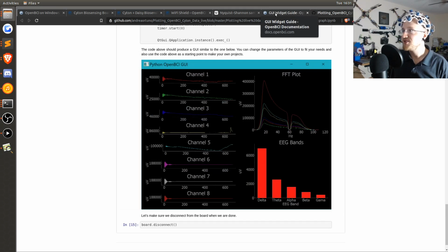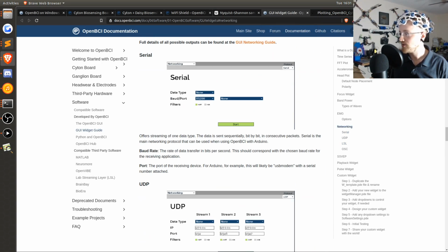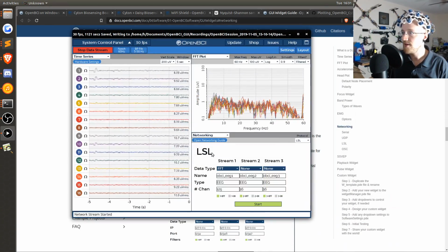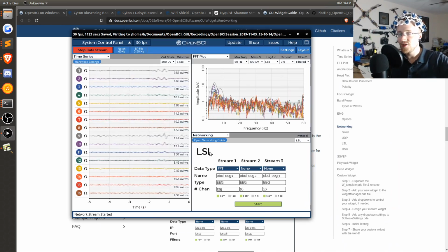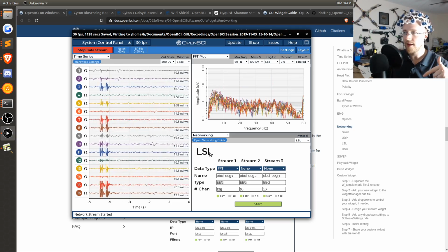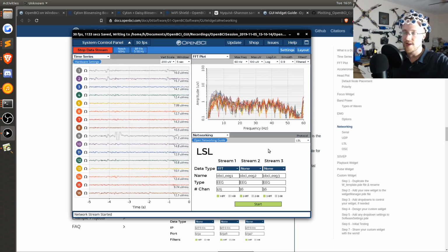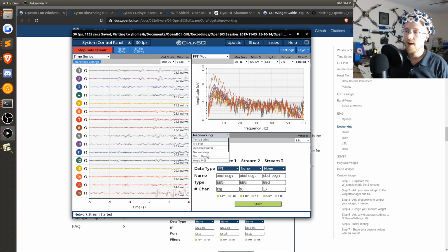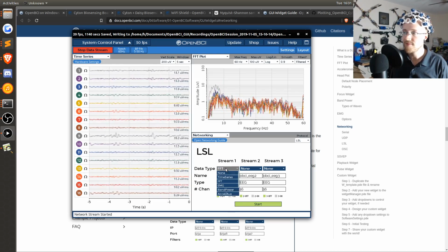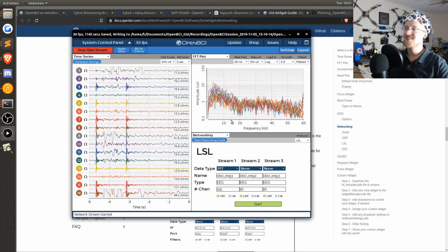But then I was linked to the actual GUI, which has a section which was up initially called networking, which allows you to take anything you want from here and pass it to Python over something called LSL, which I had never heard of. I think lab streaming layer. Basically, if you use this, you can just set a constant stream over Python, which I'll show in a little bit. And then you just connect to it, right? And then you can choose what you want to pass over that stream. And I was like, yeah, fast Fourier transform, let's do it. So that's what I wanted.